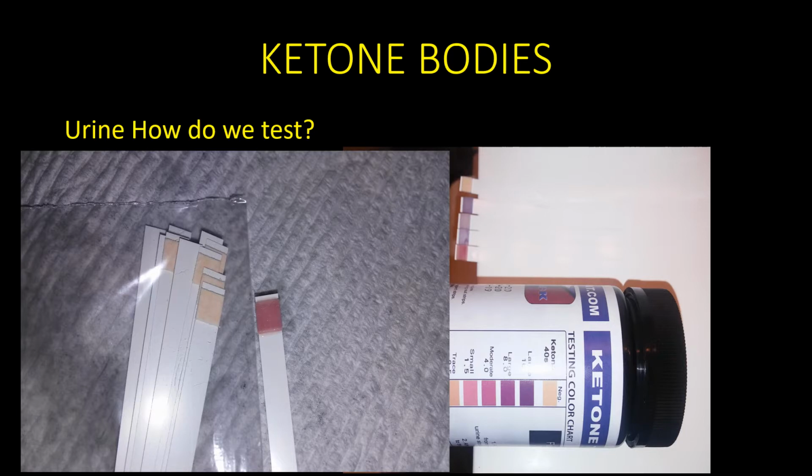Here you can see there's a test strip that shows a score of approximately 4 millimolars, which a millimolar is just a unit, and everything you measure is going to be in different units, and really all you got to know is what your goal is. And 4 millimolars is right in the middle. You could see some of those test strips that I tested before.